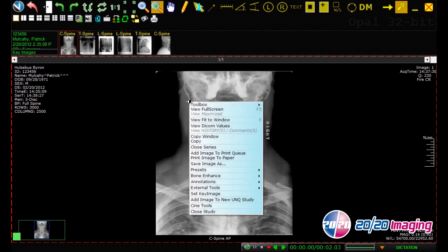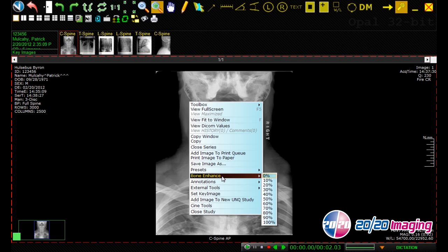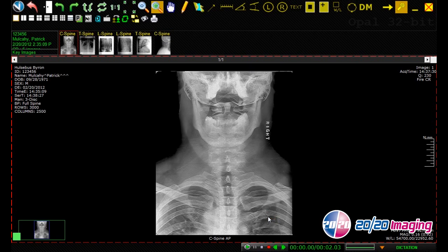The bone enhance feature can be accessed by right clicking on the image and selecting bone enhance from the drop down menu. This allows us to sharpen the visibility of the bony cortex and trabeculation.